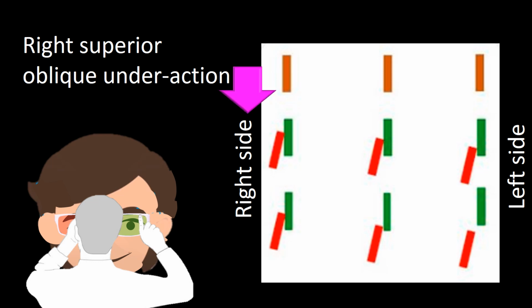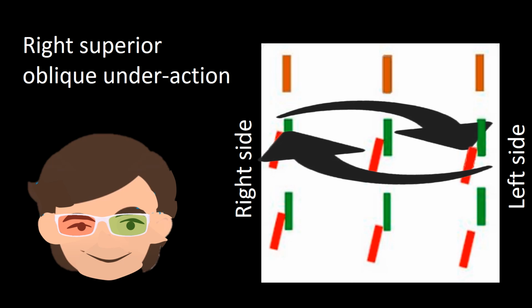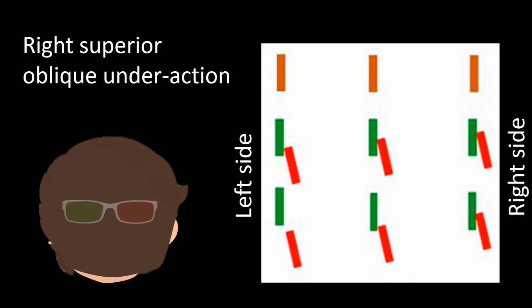So the right side of the chart corresponds to the right side of the patient and to the left side of the doctor, whereas by convention for bar diplopia chart interpretation, the chart is flipped. Hence, the right side becomes the left side, and as a consequence, the intrinsic relations of the bars in each case changes. This is so because bar diplopia chart interpretation is done with a chart viewed from the patient's perspective.